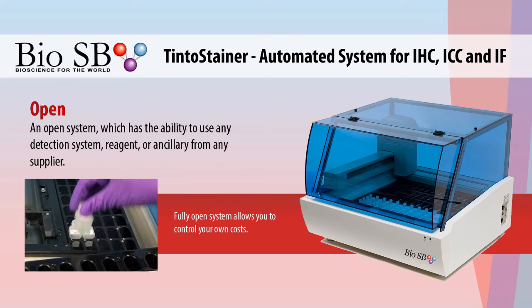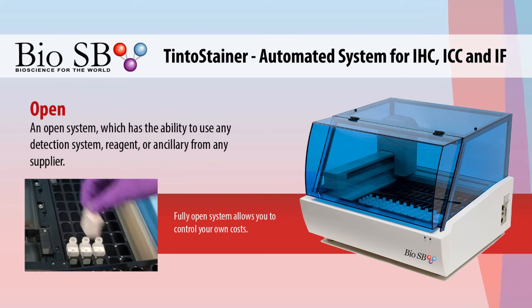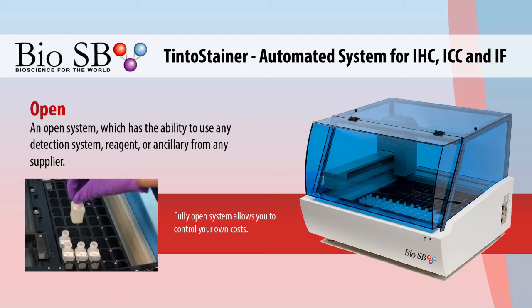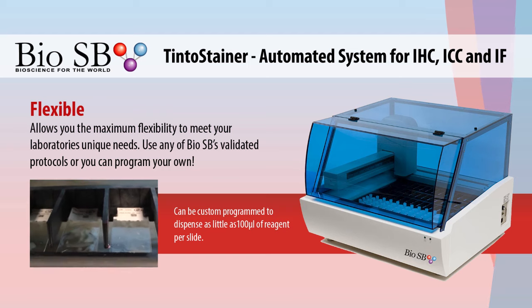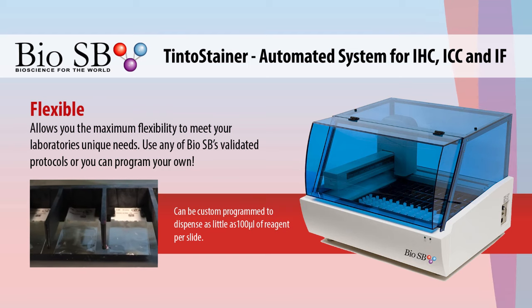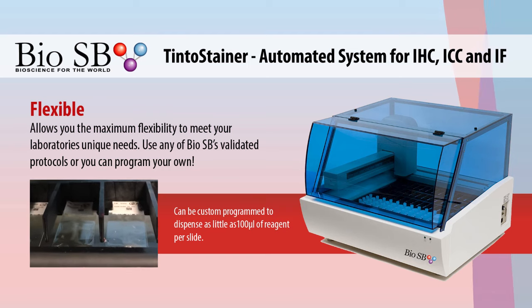This system is completely open, giving you the ability to use any detection system, reagent, or ancillary from any supplier, allowing you to control your own costs. With complete flexibility, you can use any of BioSB's validated protocols or program your own.